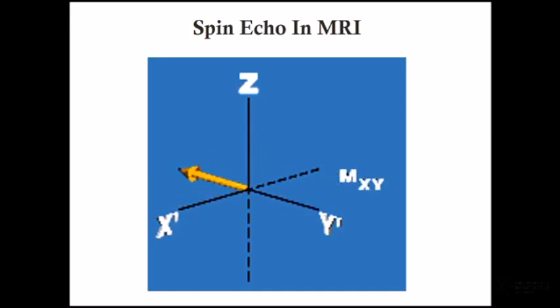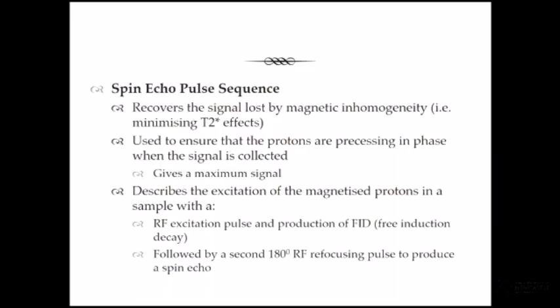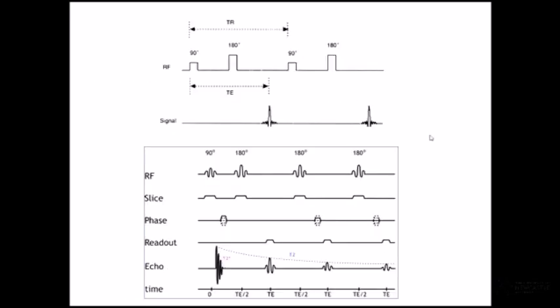So if we wanted to do a T1 weighted scan, we will say that our echo time that we want to collect it at is 25 milliseconds. So when you're sitting there as the radiographer and you're saying, I want to do 25 milliseconds, what that's doing is going back to that pulse sequence and choosing how long this time is.